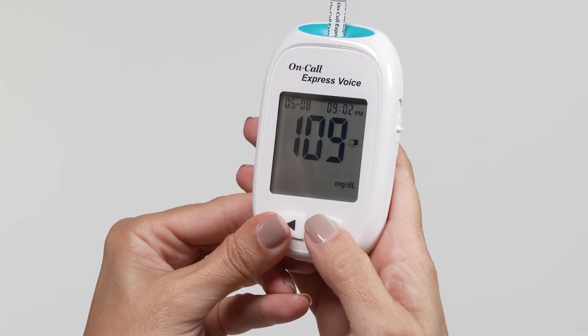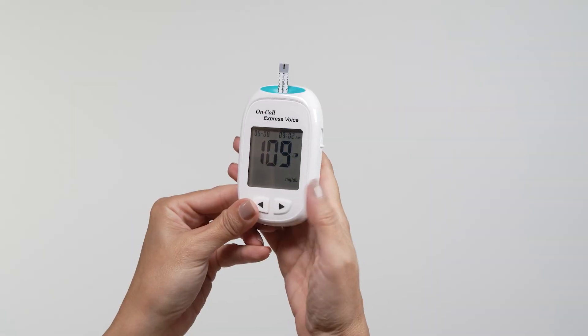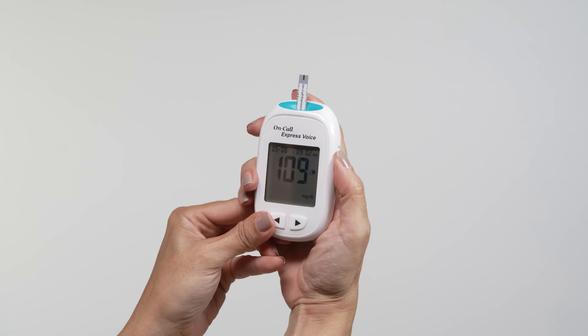If an invalid result is marked, run the test again with a new test strip. Slide forward the strip ejector to discard the used test strip.